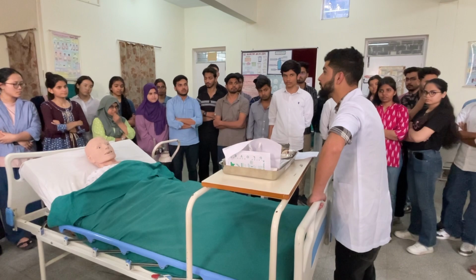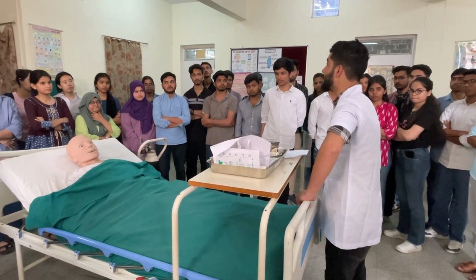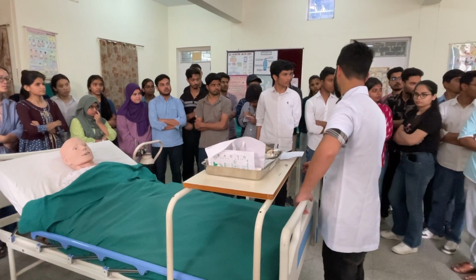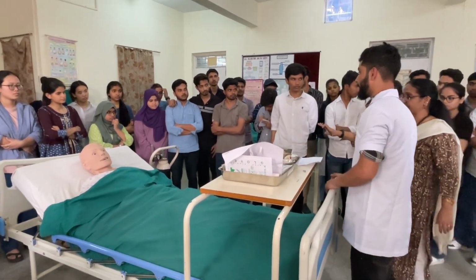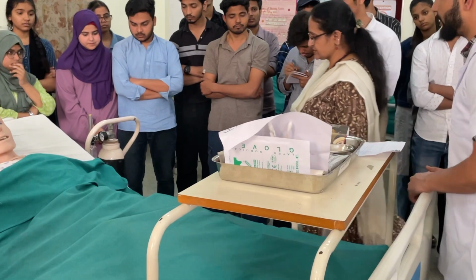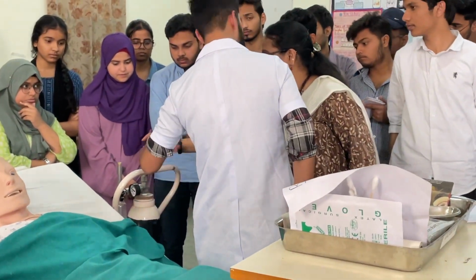Why? Because oil can ignite. This is one more point. Where exactly should oil not be applied? On the top of the cylinder. Top of the cylinder means here, as well as here.